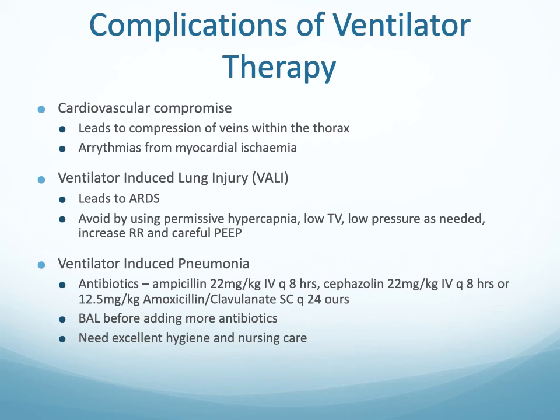These patients can't cough, they have reduced ciliary action, and we're touching around their mouth, sometimes without gloves, and we're sticking probes around the trachea.